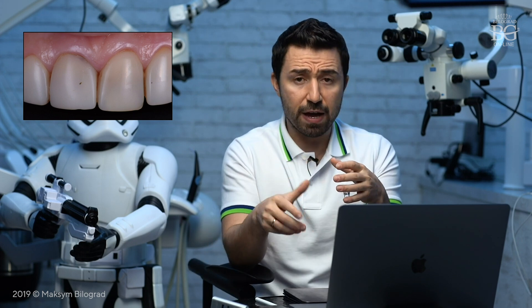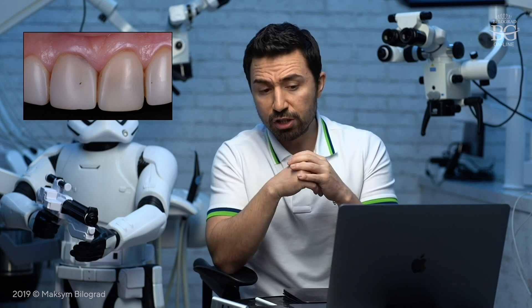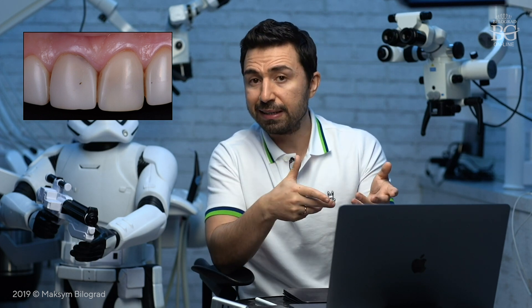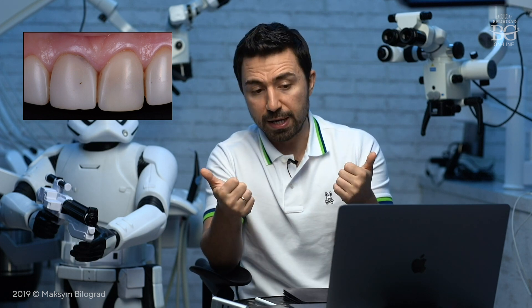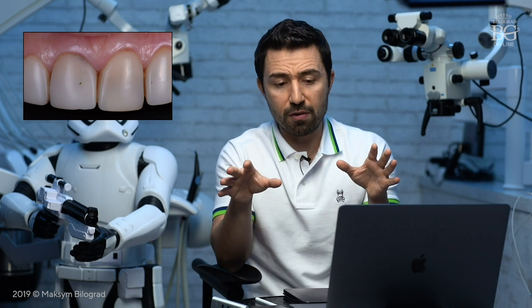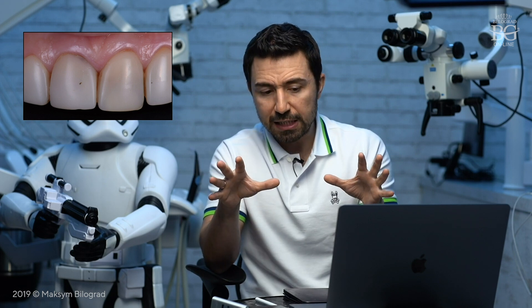If I have cases with caries defects, necessity to do fillings, or root canal treatment, I will get benefits from prepping teeth with rubber dam. In the rest of the cases — no caries defects, or teeth already prepared with new fillings — I can just use an optragate to prep them.